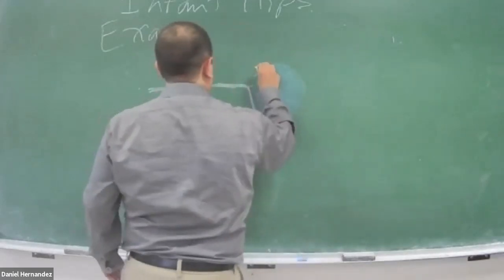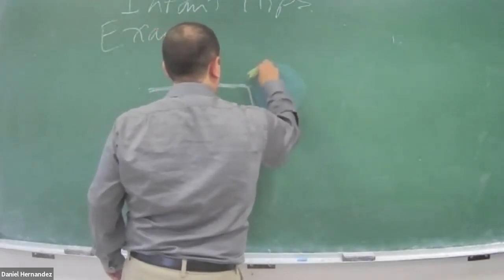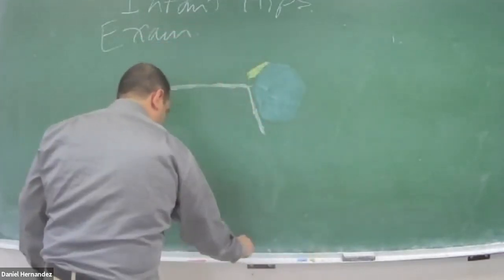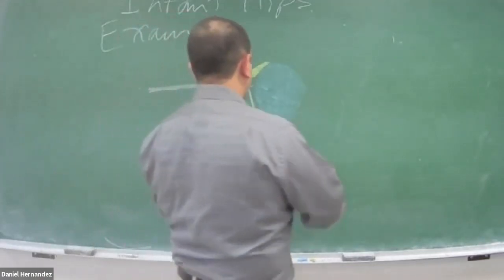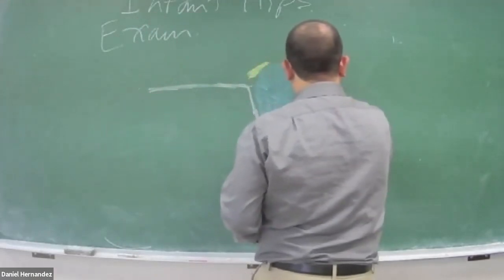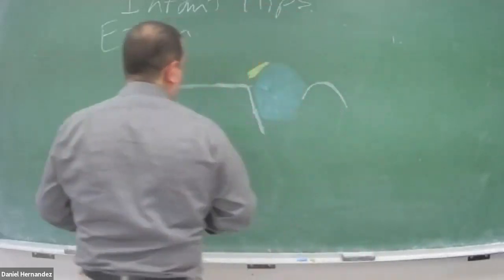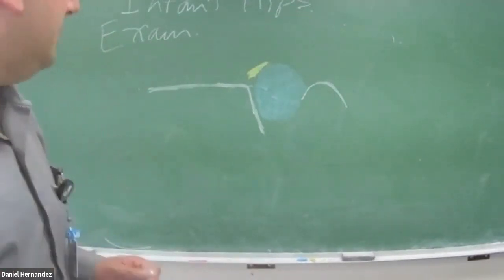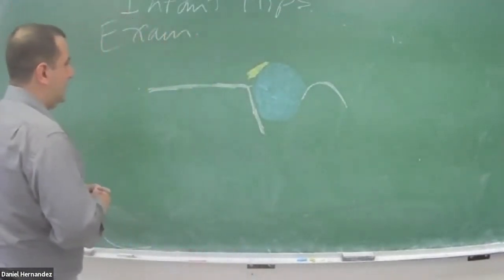You want to be able to also visualize your labrum. Trochanter. So like I said, when you're doing your exam, that's the view you really want to get, focus on trying to get a good picture with your labrum in the picture.